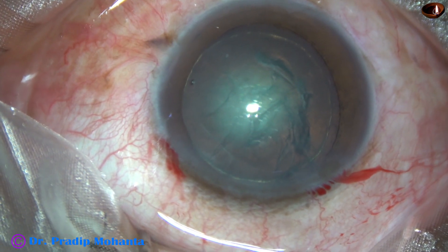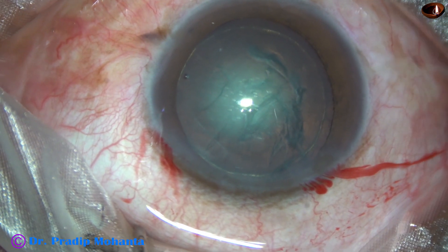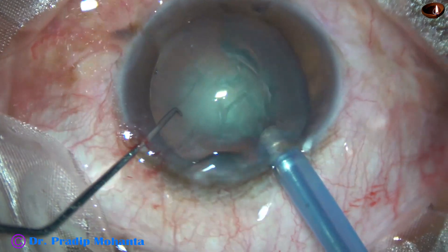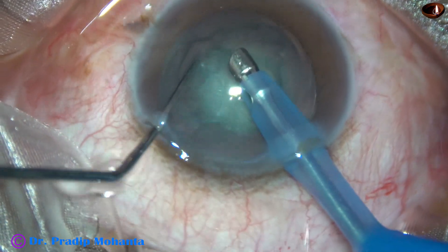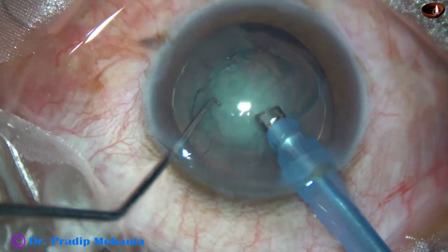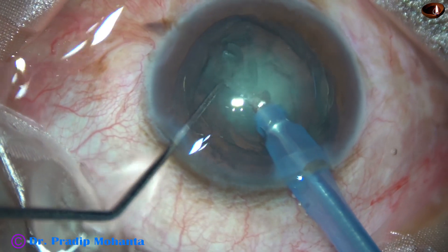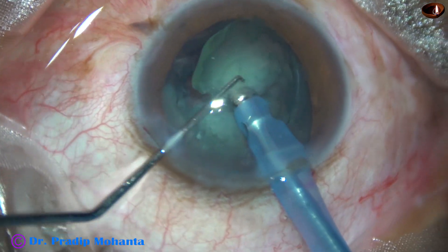Now is the time to introduce the tip of the FECO needle in the anterior chamber. The FECO needle goes in with its bevel down. Some superficial cortical lens matter and epinuclear matter is aspirated. Then the FECO needle is turned to make the bevel up and it is chopped into two heminuclei.